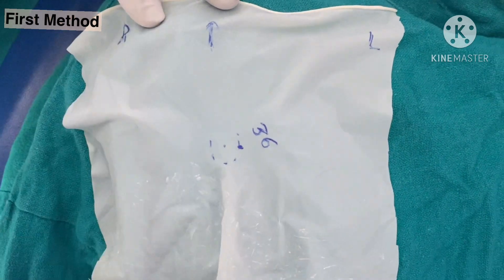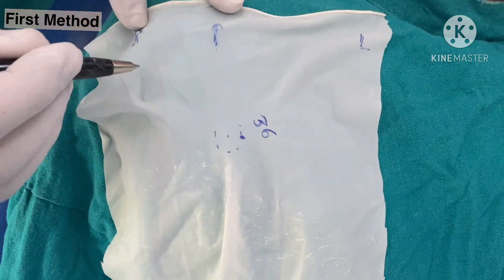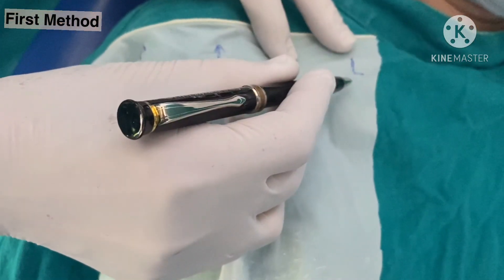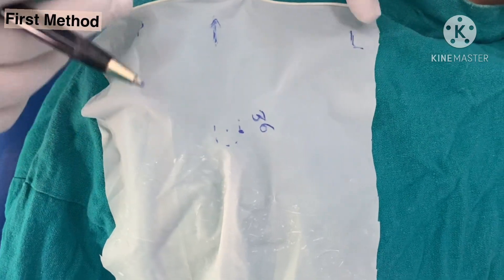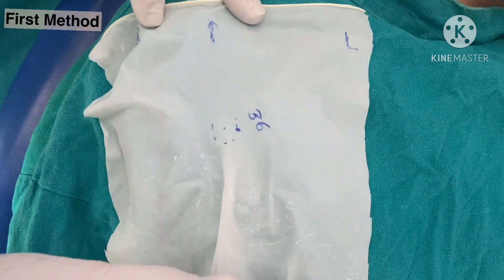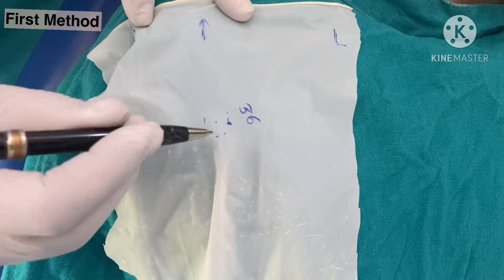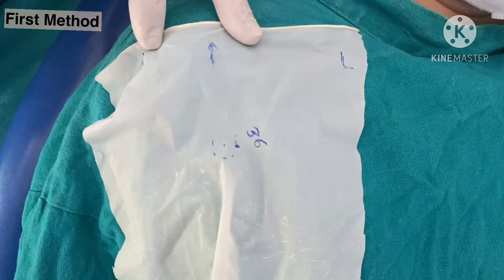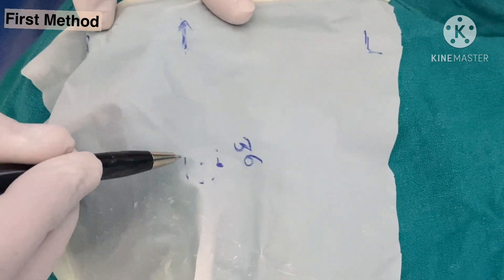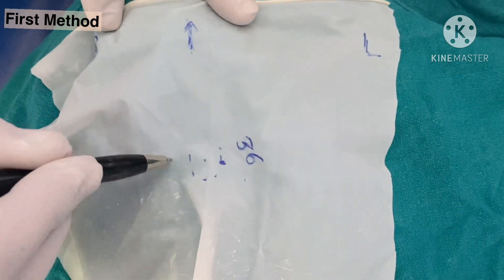This is the rubber dam sheet — it is cut out of the examination glove. Now we mark the right side and left side, so this part has to be towards the nose. We divide the whole rubber dam into four quadrants like this and put a dot in the center. Then we draw the lower jaw. Mind you, this is a narrow circle, not a broad one, as we do it normally.